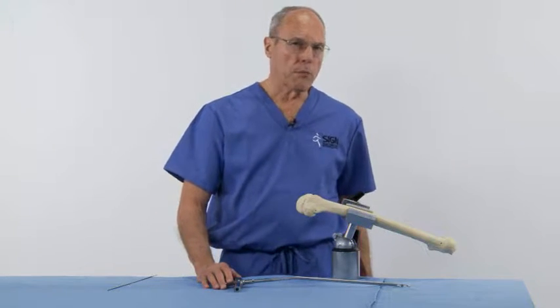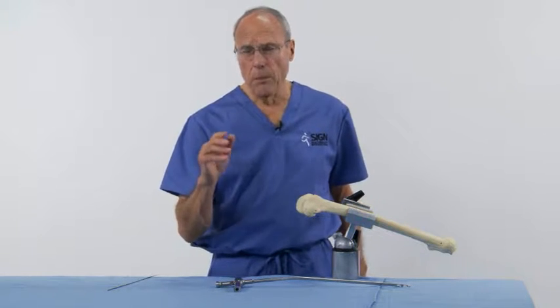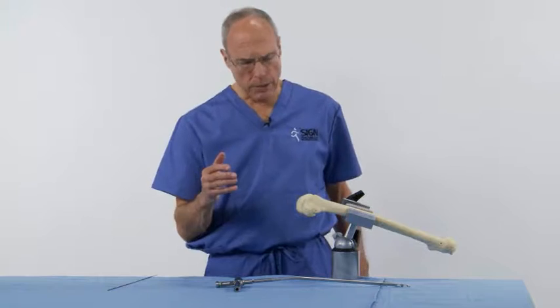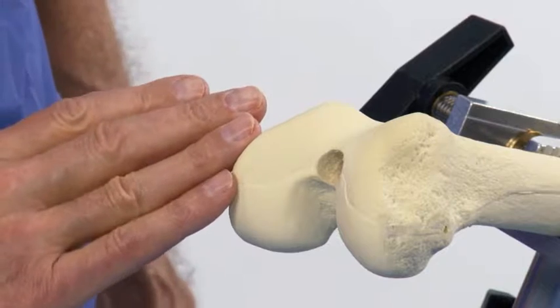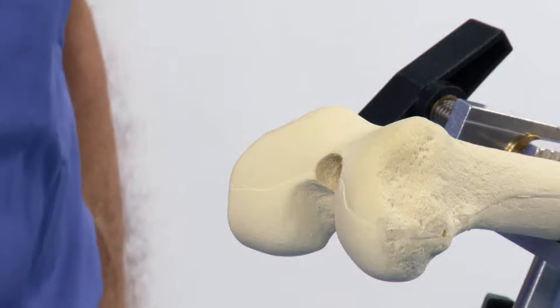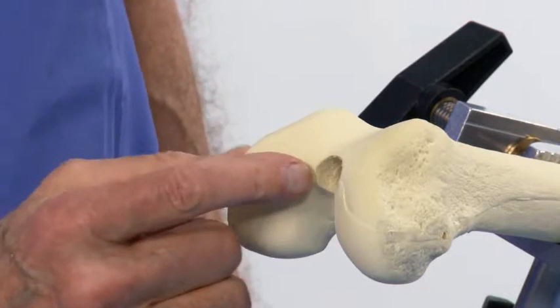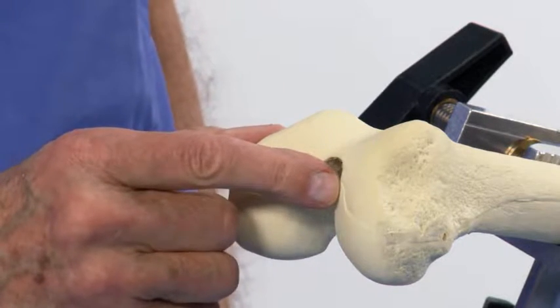Once the incision has been made, you must make a window through the fat pad. I use a knife and a pickups to do this, and some people use a cutting cautery. Once the hole or window is made in the fat pad, you can visualize the femoral notch. Flex and extend the knee in order to get better visualization of the femoral notch. The bony entrance for the reaming and insertion of the nail is on the medial side of the femoral groove. This is more in the center, but it's on the medial side of the femoral groove.